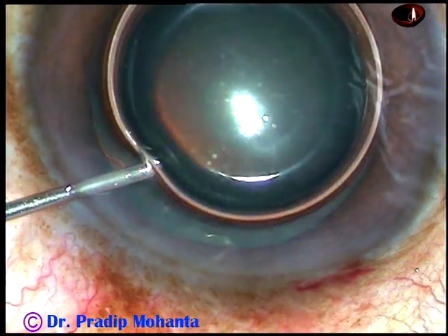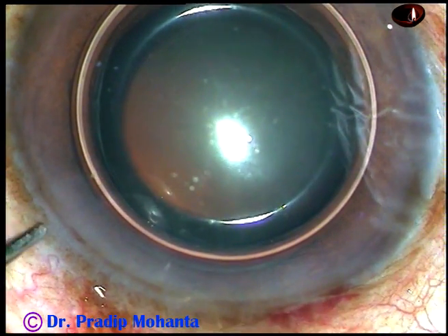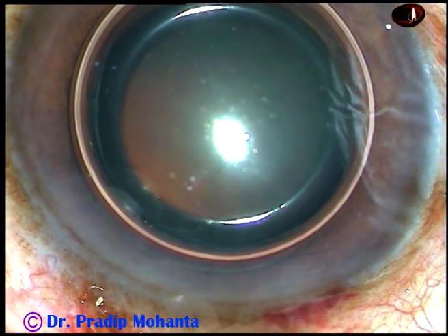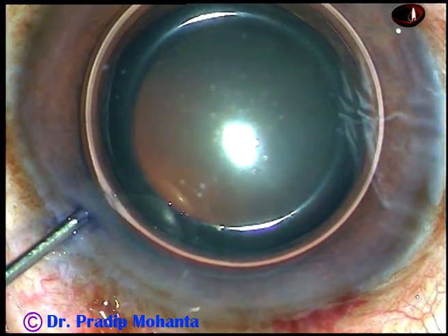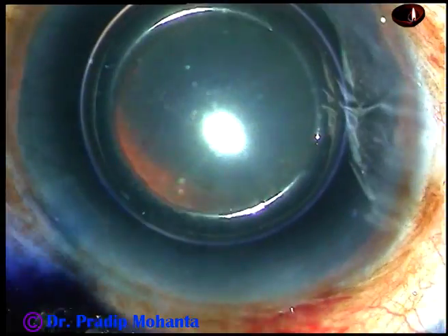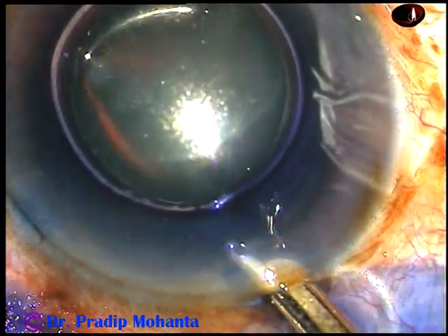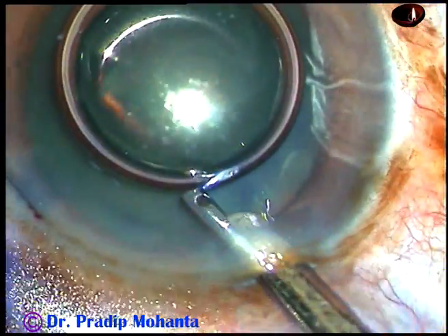This is an air bubble. I want to stain the anterior capsule with trypan blue dye to show the capsulorhexis very clearly. The dye is injected over the anterior capsule, and now the dye is washed out with BSS.